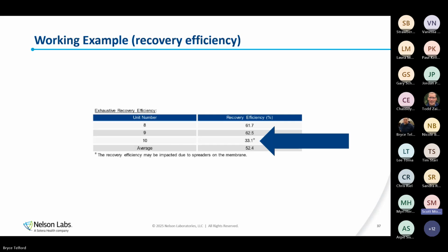Bioburden is more important in dose-setting sterilization, like gamma, than it is in EtO. So should we place a higher level of scrutiny when we are evaluating bioburden reports when we are working with gamma product versus EO product? The short answer is yes, very much.